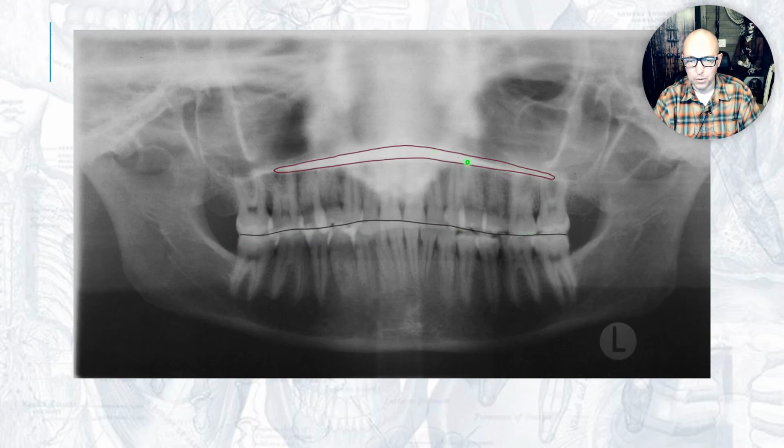Makes me really sad. Why? That's what I tell students. It makes me sad because now you can't diagnose. So when patients are sad, we're sad, everybody's sad. Make them happy. That's chin up.